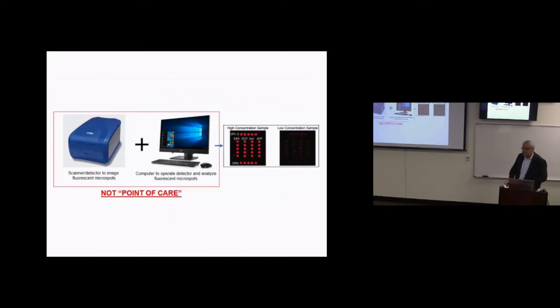Okay. But so far everything I've told you has been a bit of a lie, because I didn't tell you how I was imaging the spots. How we were imaging the spots was to go down to the second floor and use the many obsolete microarray scanners at Human Genome, what used to be IGSP, the Institute for Genome Science and Policy.